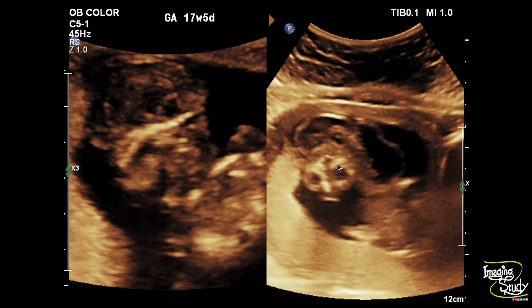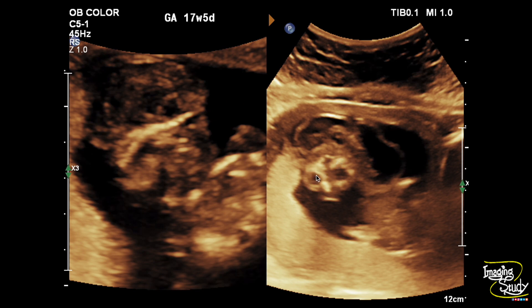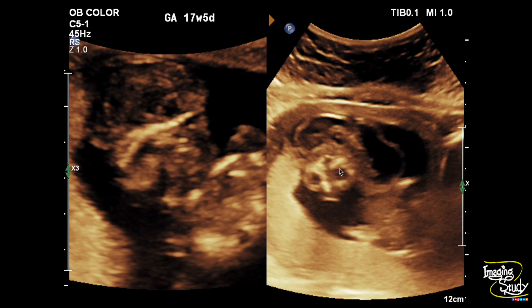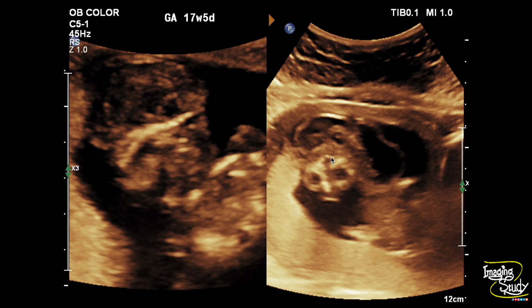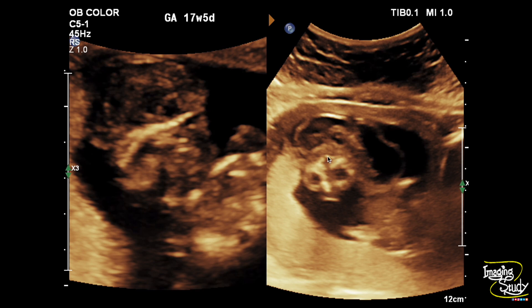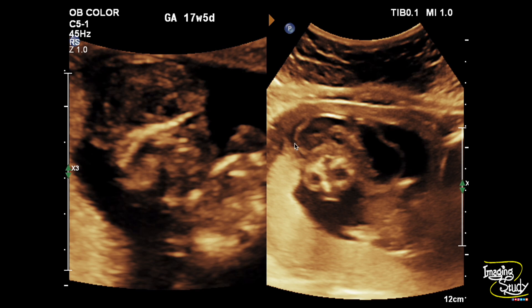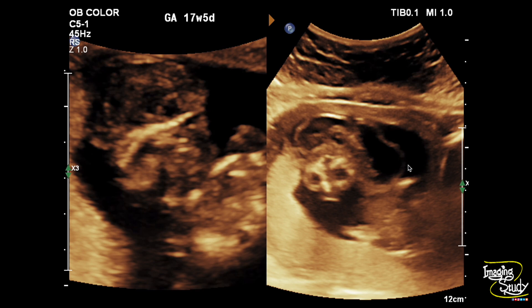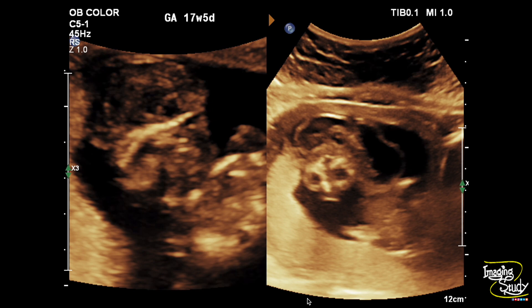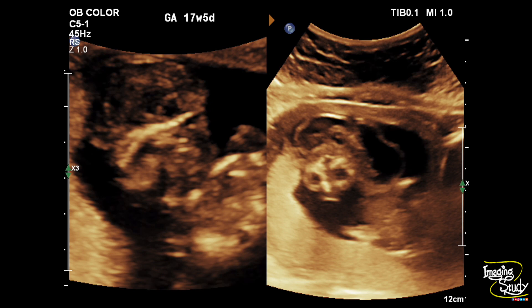On the right image you can see the facial region. These are the orbits. If it was a case of exencephaly, then you wouldn't see these bones above the orbits. Due to herniation of the CNS contents outside, the head became smaller. So this is not a case of exencephaly; rather it's microcephaly due to herniation.